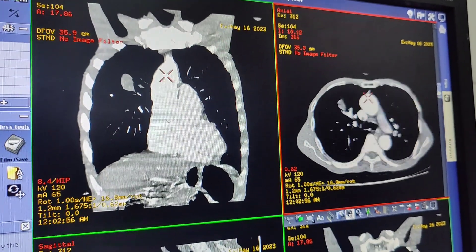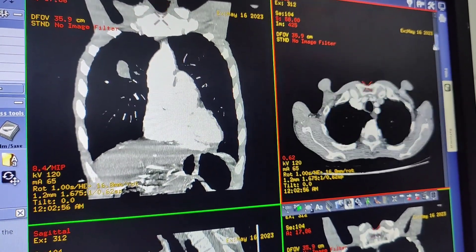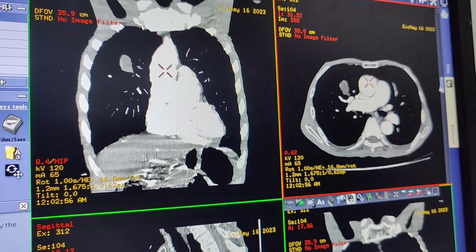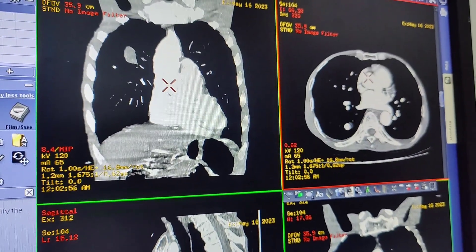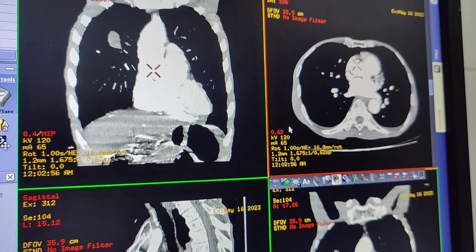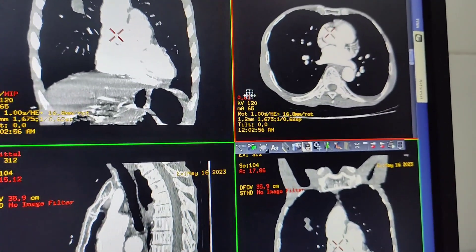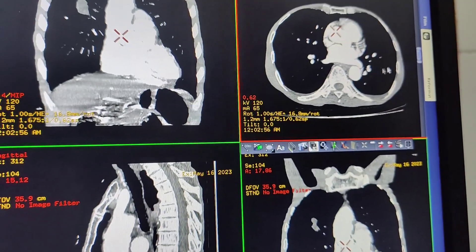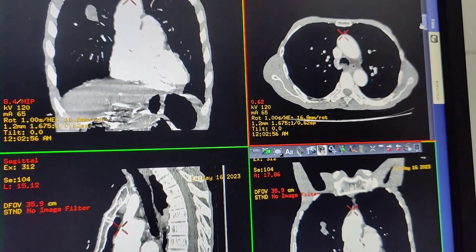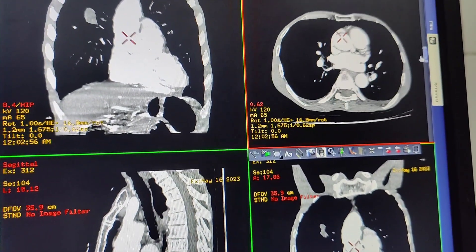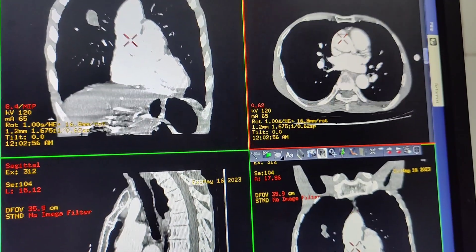We're going to go through some aspects of minimum, average, and maximum intensity projections. Where the red number is — 0.62, where the cursor is — that's the thickness of this current view of these images of the lungs, of the chest.